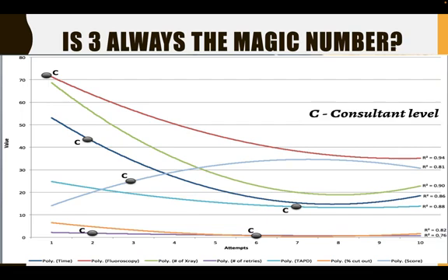It's also important to mention that whenever you ask somebody to have a go on a simulator, there's always going to be a learning curve on using the hardware as opposed to being able to fully engage with the clinical exercise in front of you. So it is slightly unfair to compare it to the consultant first time attempt, because on the first time, even the consultants are familiarizing themselves with the machinery and the hardware, not just the software and the clinical exercise. But it goes to show that with persistent practice, using the same simulator, even novices, including medical students, are able to show comparable results to expert consultant orthopedic surgeons. And this is for DHS surgery only.